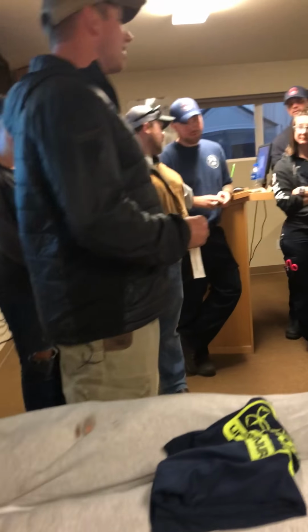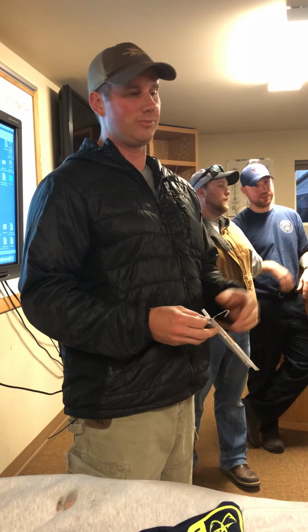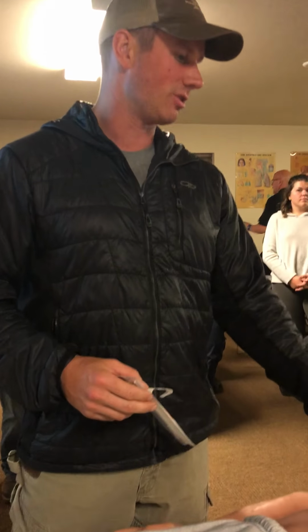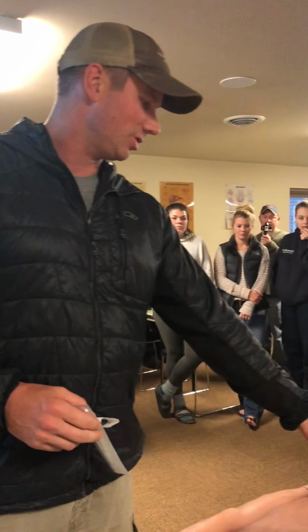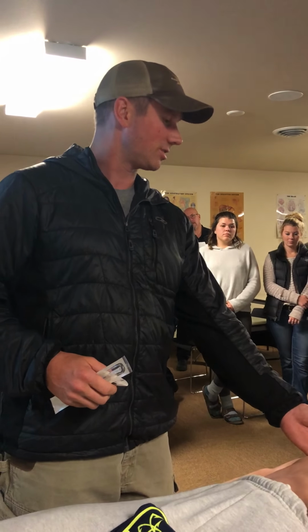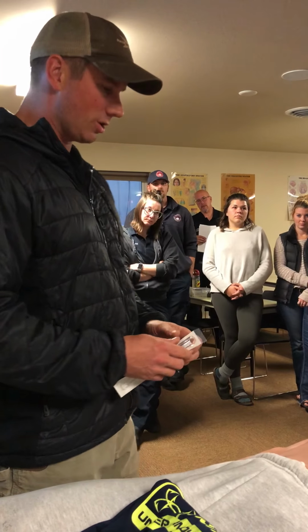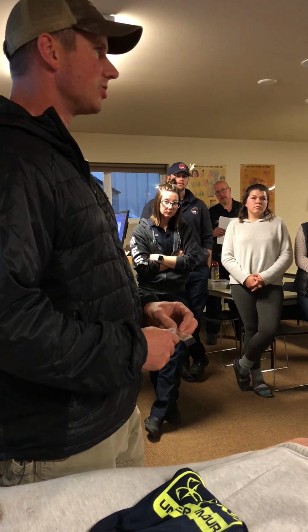So the alternate site for chest decompression that's available to you is the anterior axillary line and the fifth intercostal space. That's about at the nipple line, in the anterior axilla. The reason we're going anteriorly is that if someone is on their back and has a pneumothorax, rather than the mid-axillary line, the air is going to be up higher. So we want to access that. It decreases the chance of lung injury, because that air is going to be anterior.